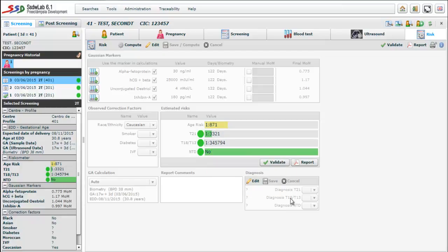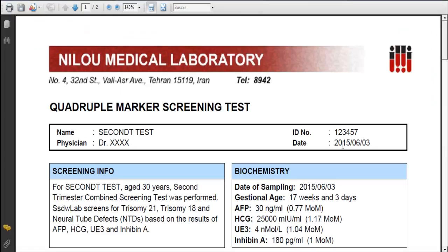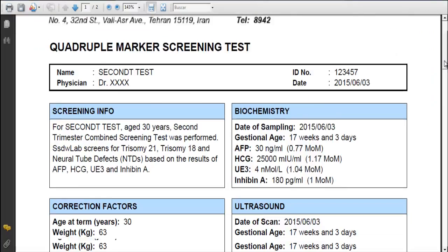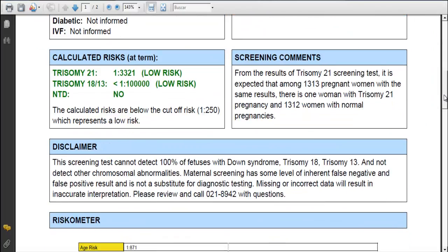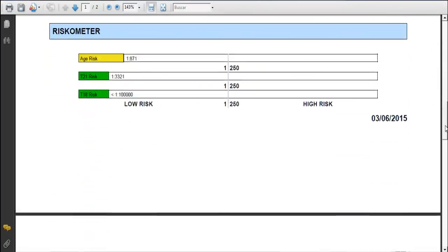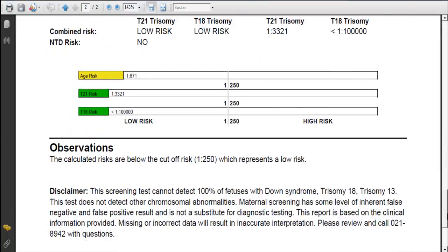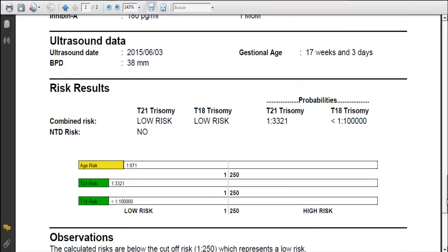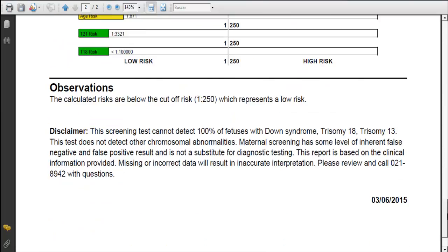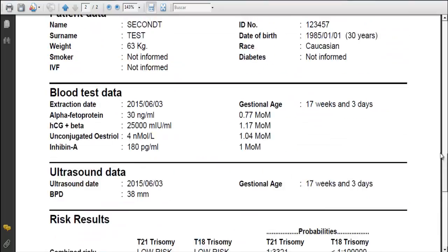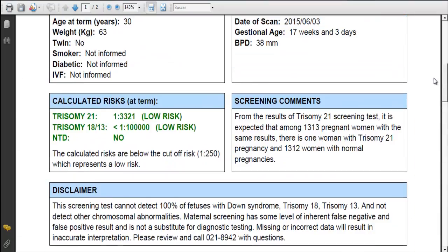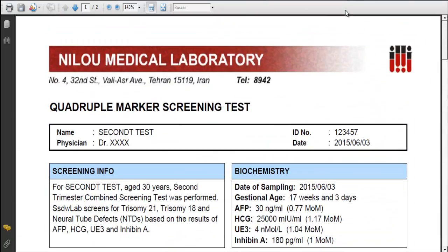We can observe the presence of two buttons. One is the validate button for validating the screening, and the other is the report button. If we click the report button a report in PDF format is generated in a new tab. What we see is what will be reproduced in the printed report. We can see represented in bars risk for age, risk for trisomy 21, risk for trisomy 18-13 and neural tube defects risks. So following these steps we have performed different kinds of second trimester tests.